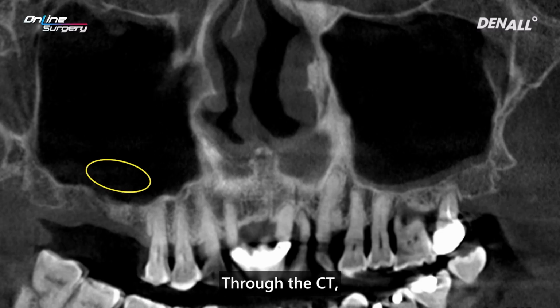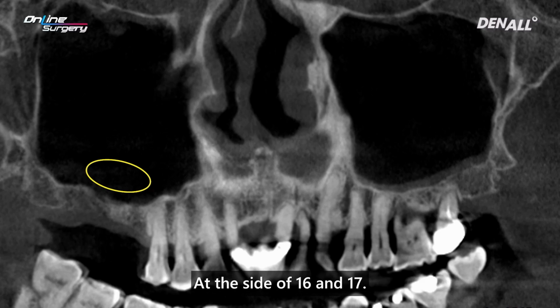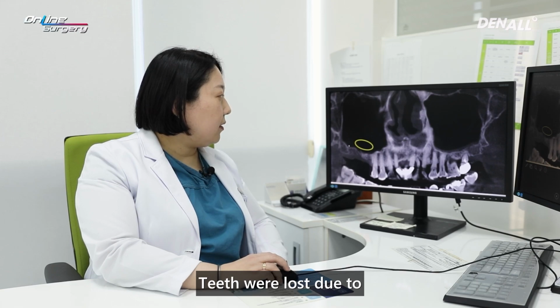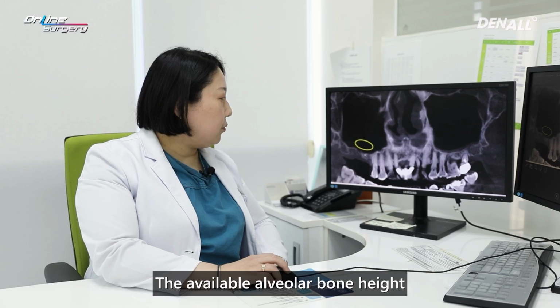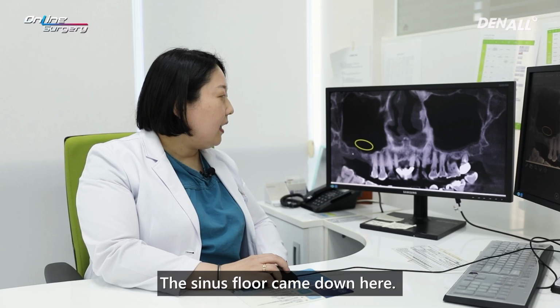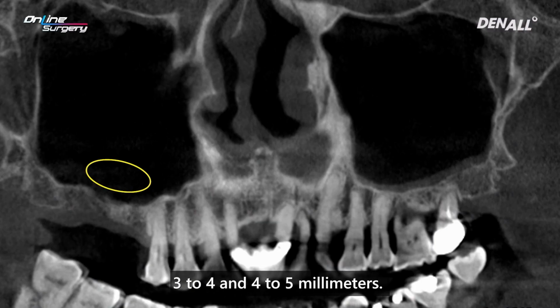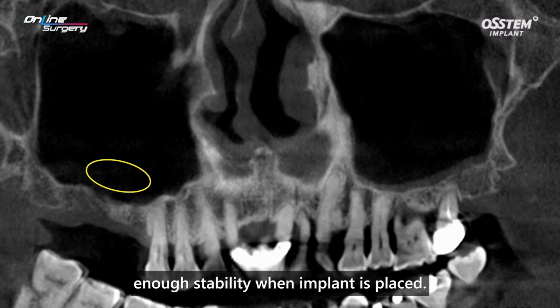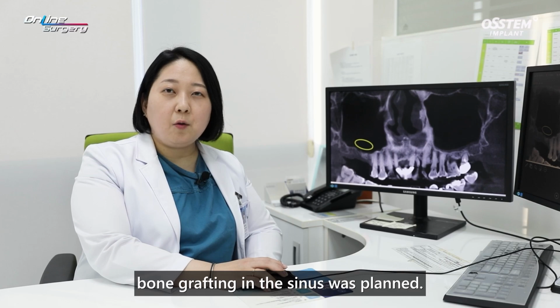Through the CT, patient's alveolar bone condition was confirmed. At the site of 16 and 17, teeth were lost. Due to the pneumatization in the maxillary sinus, the available alveolar bone height is expected to be very restricted. Sinus floor came down here. Available bone height would be approximately 3 to 4 and 4 to 5 millimeters. So it was decided that we will not get enough stability when implant is placed. Therefore, implant placement simultaneously with bone grafting in the sinus was planned.